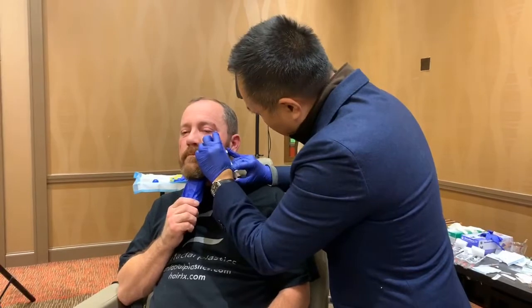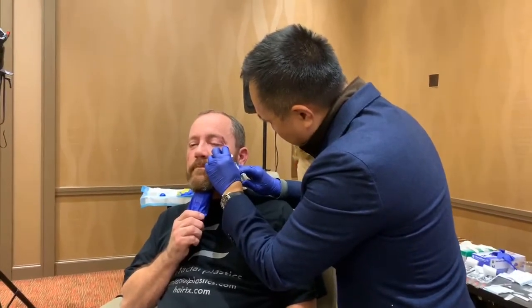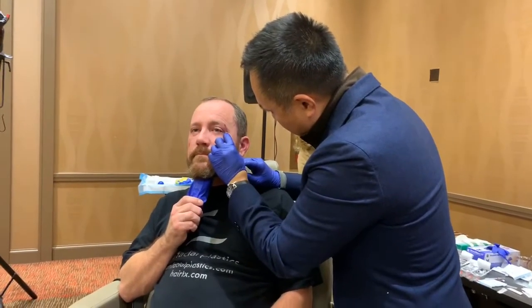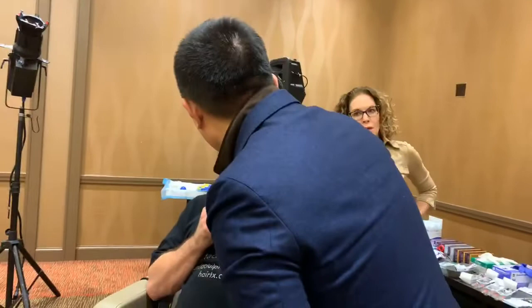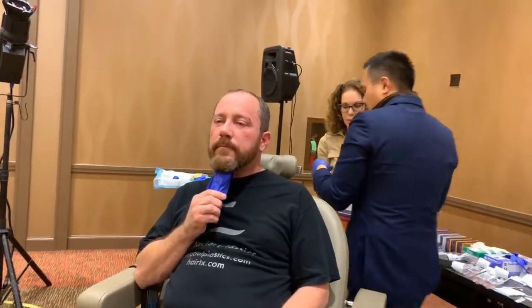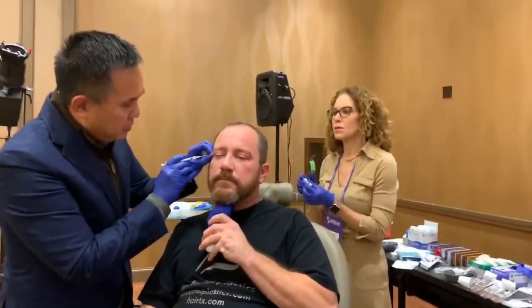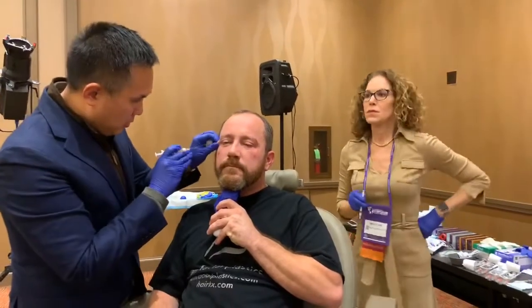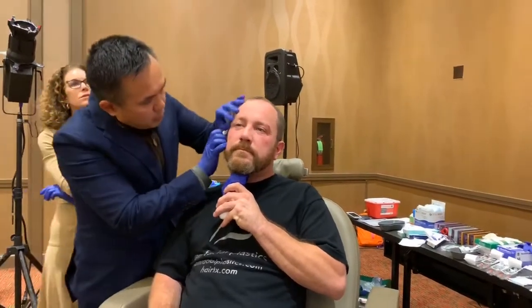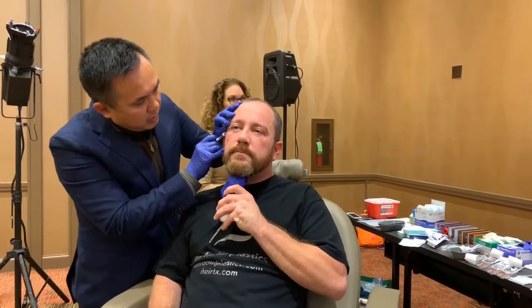I just like to put a little bit in and then I can gauge how much skin to remove, because most of it is going to be corrected with volume. Look a little higher — about right there. Look straight at me. Laterally I'm very conservative with total volumes. The book I wrote about fat grafting — I talked a lot about lateral volumization, but aesthetically I've evolved. I'm now very conservative laterally and much more aggressive medially. The concept of that asymmetric triangle helps me see that better.